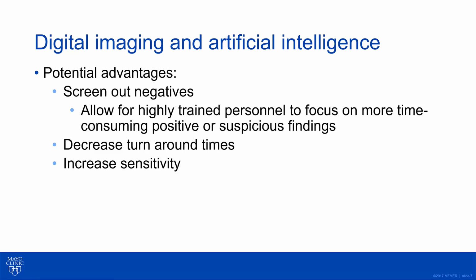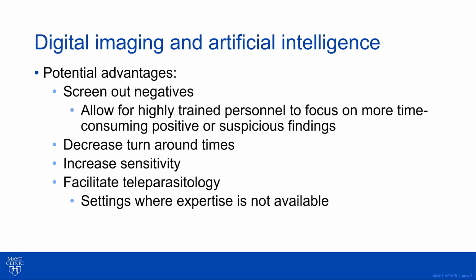parasites. Artificial intelligence algorithms don't suffer from fatigue and will continue to maintain sensitivity throughout the day, whereas traditionally microscopy workers may suffer from fatigue and ergonomic injuries from continuous review of slides. It could also facilitate telepathology, settings where expertise is not available, and it could be used for teaching. And last but not least, there may be an opportunity in the future for our technologists or other professionals to work from home and view digital images in that location.